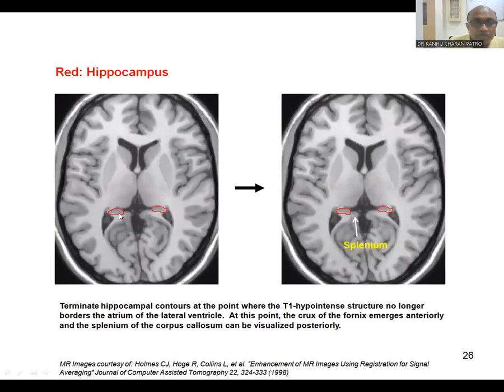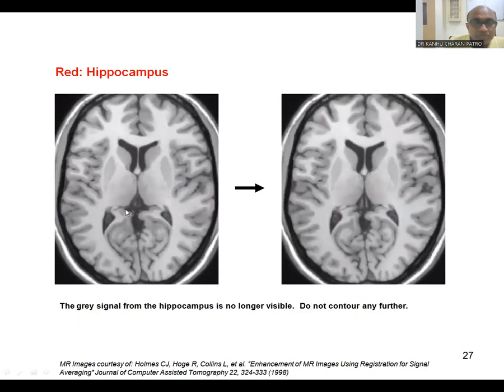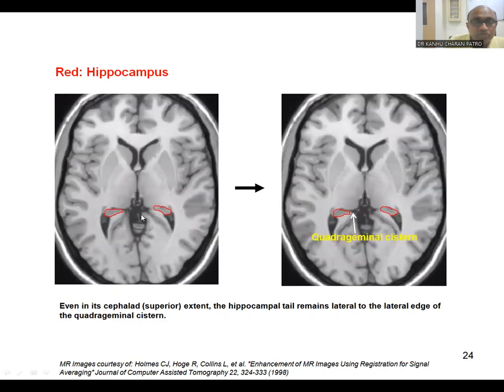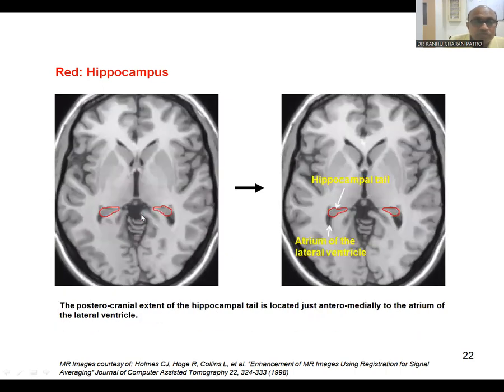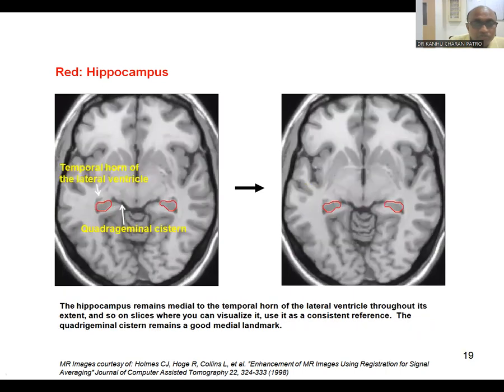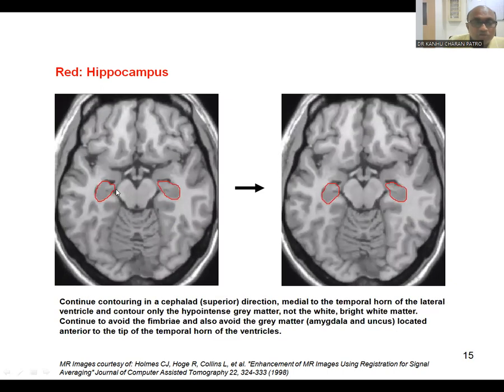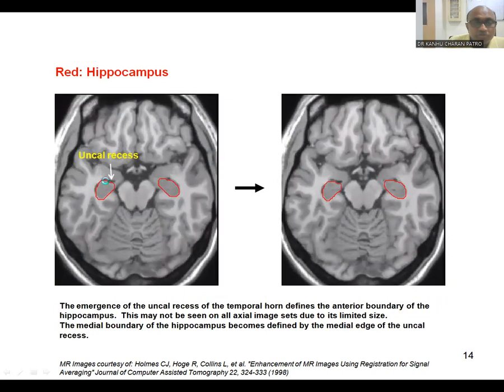When the hypointense area finishes and the fimbria starts, that is where you should stop contouring. Remember: this hypointense area corresponds to the quadrigeminal cistern superiorly. The posteromedial part of the temporal horn should be contoured.